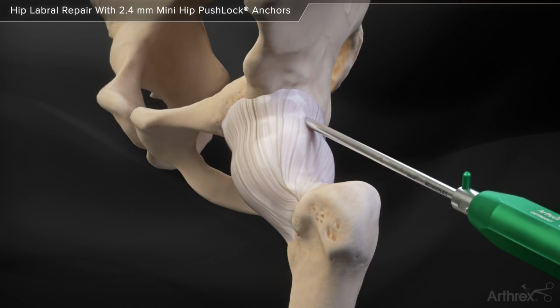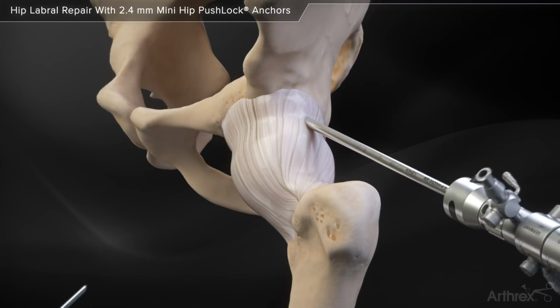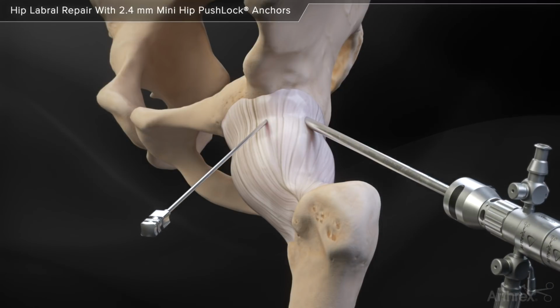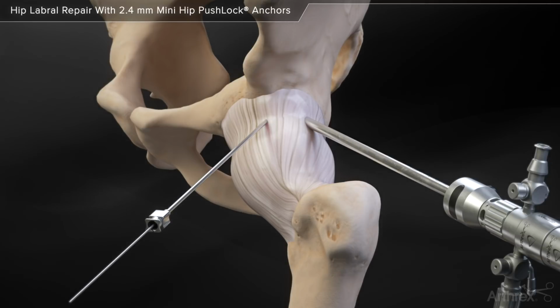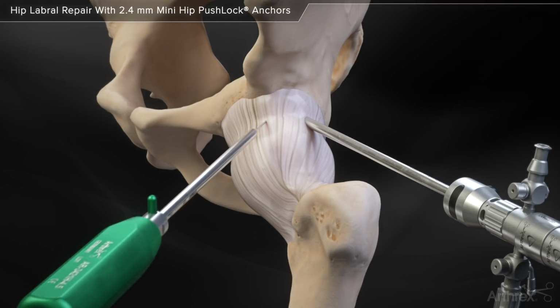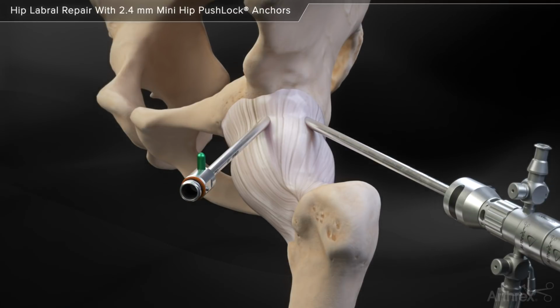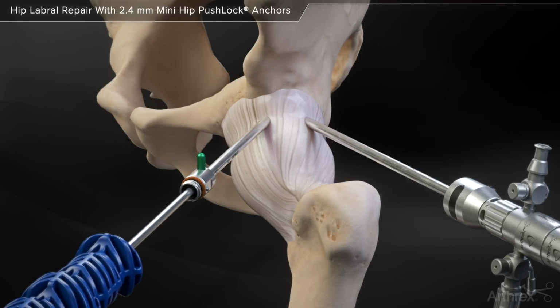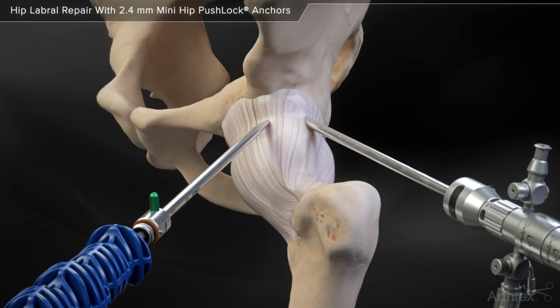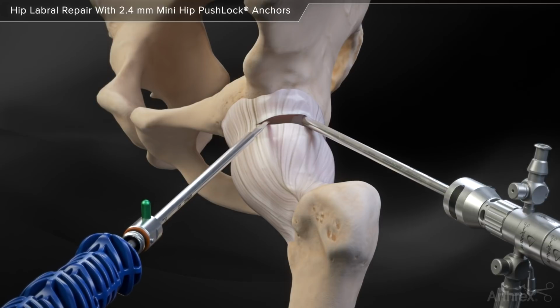Next, a metal cannula is introduced over a cannulated obturator and an arthroscope is inserted through the cannula and into the joint. The mid-anterior portal is then established in a similar manner. A capsule cut blade is inserted through the mid-anterior portal to create an interportal capsulotomy between the anterolateral portal.